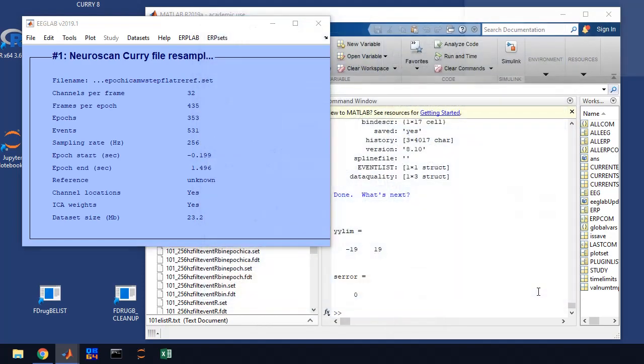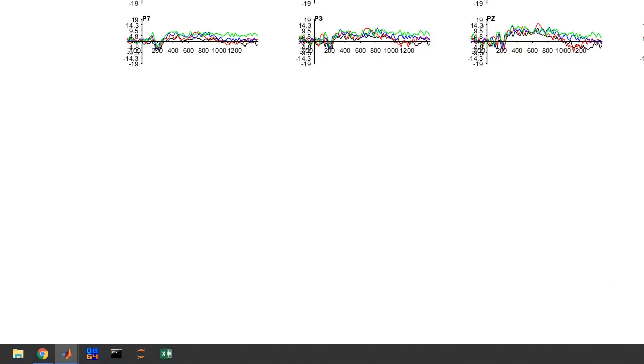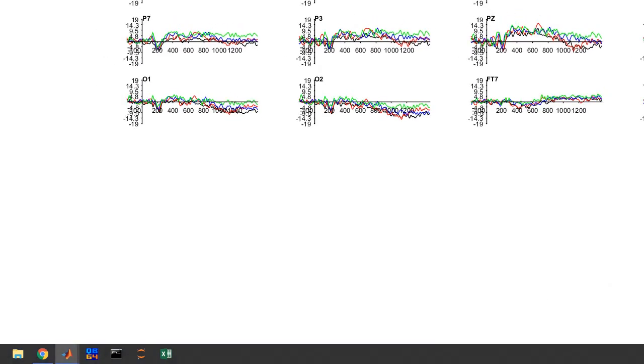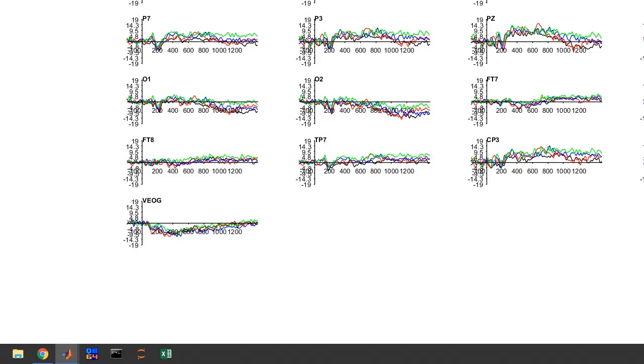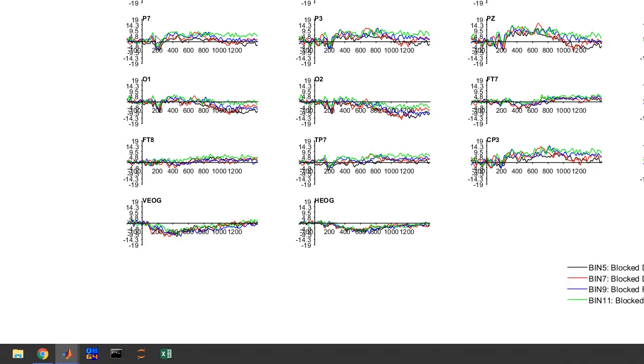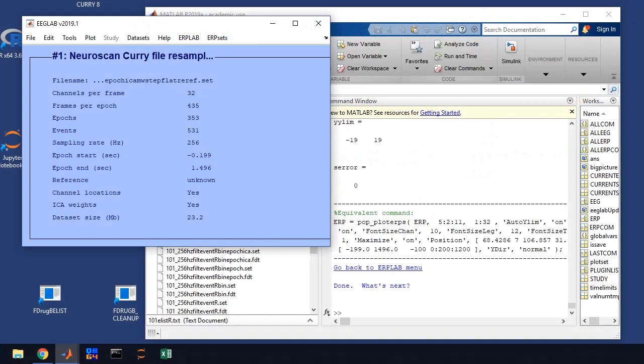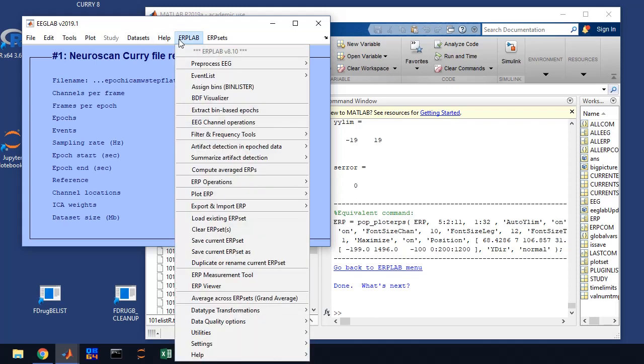So we're going to plot those. And you can just click plot and it's going to come up. It's going to be outside of the screen here. So I can't make it smaller, but it's taking up my entire screen. You're only going to see a portion of this, but you'll see electrodes with time. And what we're looking for here is, does it look good? Does it look like ERP signal? Or is it really noisy? If it looks like this, this is pretty good. And that's what we want to see. We'll see more with the maps, but we're just going to eyeball this to make sure that it's looking good at our electrodes for an individual subject.